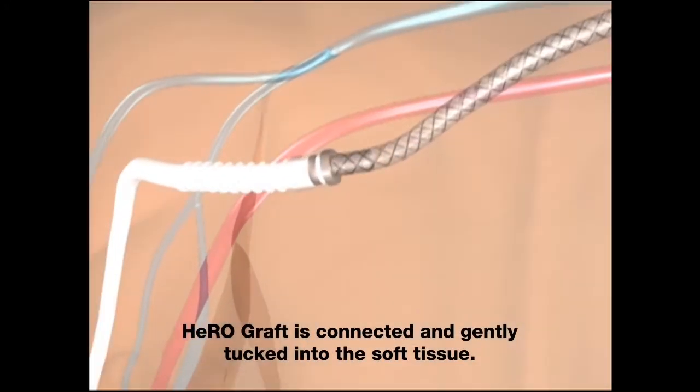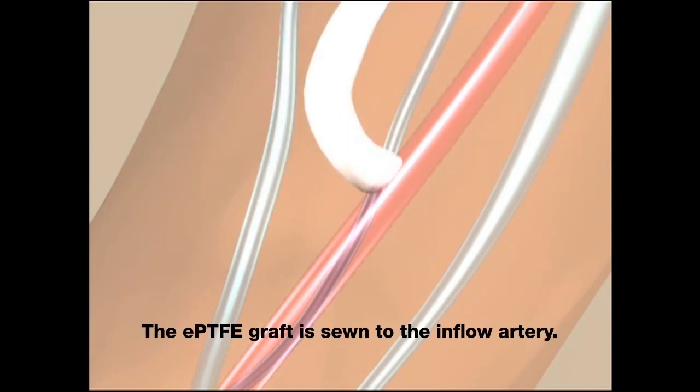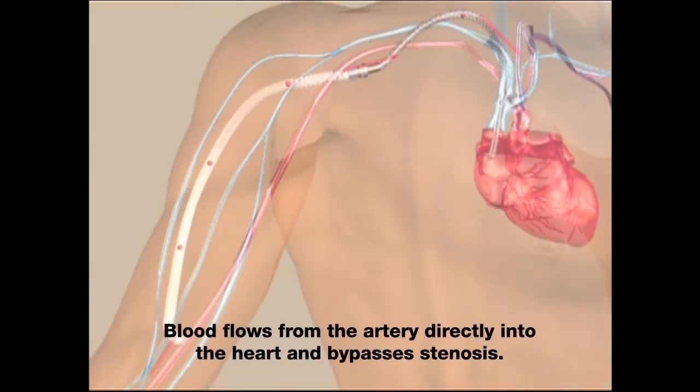HeroGraft is connected and gently tucked into the soft tissue. The EPTFE graft is sewn to the inflow artery. Blood flows from the artery directly into the heart and bypasses stenosis.